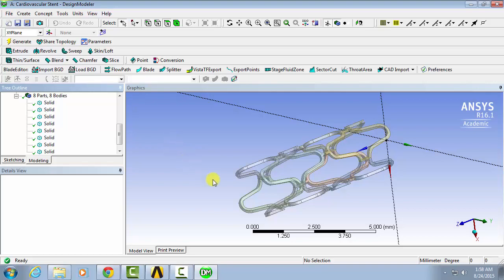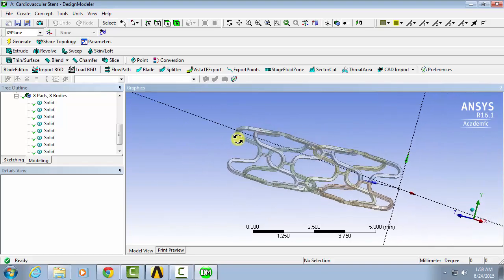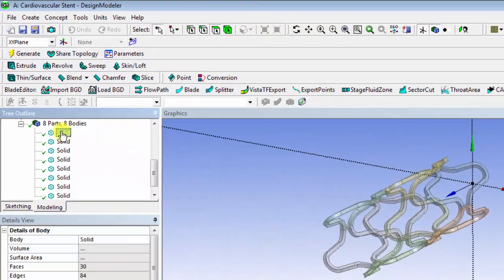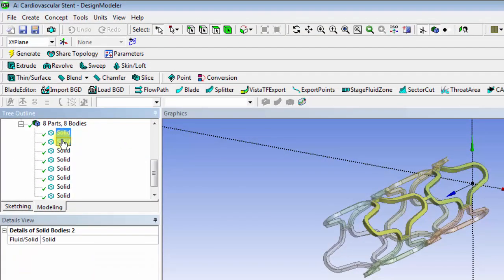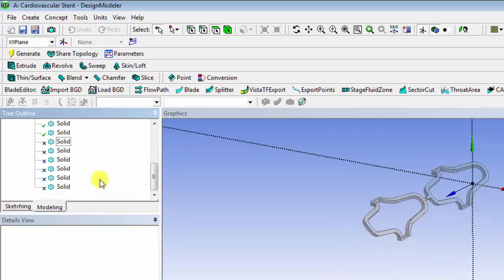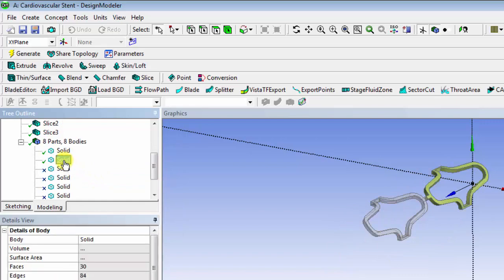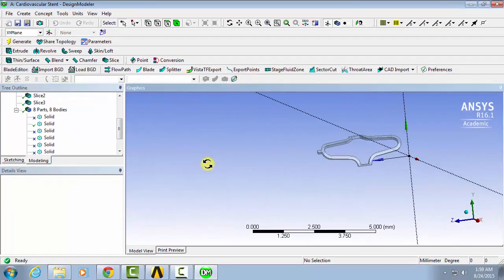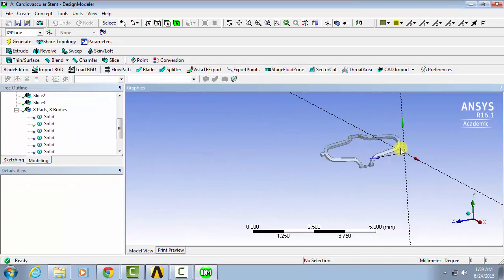Now we'll select just the part of the body that's in the all positive quadrant. So this part. So we'll go through and control click on each part until we find the one, and then control click all of the others. And then right click, suppress body. And by doing this, we are left with only 1/8 of the original model. So that will really simplify calculations in runtime.